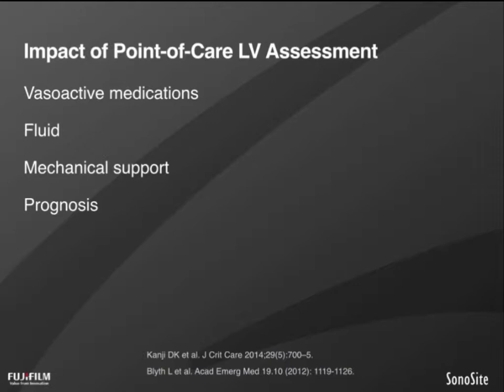For instance, the patient with previously unrecognized severe LV dysfunction who presents with multi-organ failure and shock related to an infection will obviously carry a worse prognosis than someone who can generate a vigorous cardiac response. Therefore, an accurate and timely assessment of the left ventricle will have an enormous impact on your practice when looking after these sick patients.